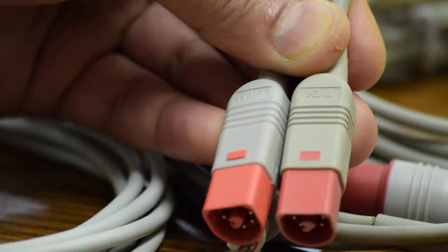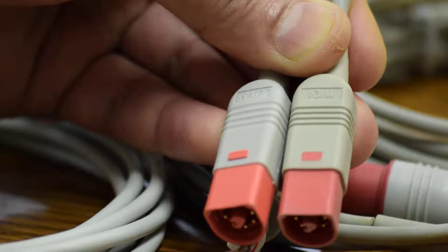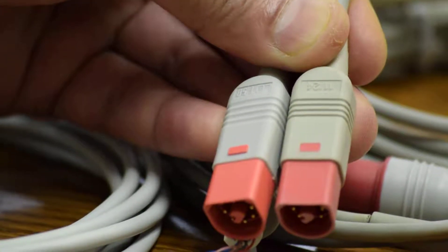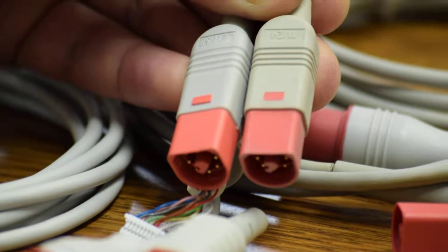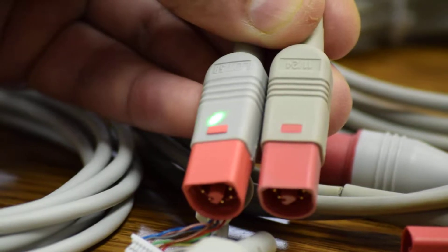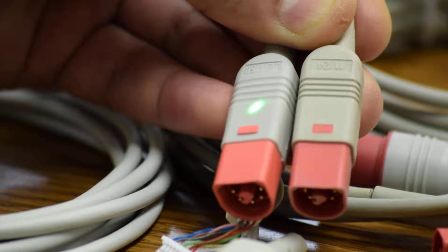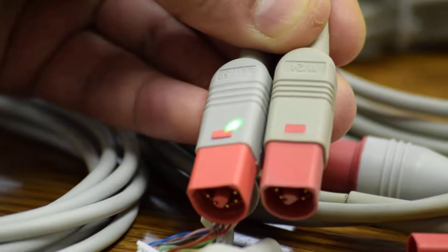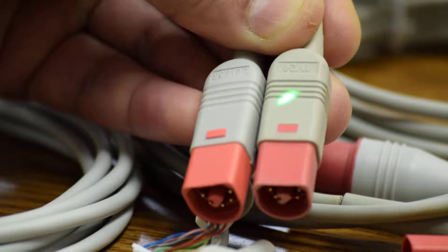Welcome to Toko Expert channel. Seen in the center here, there are two connectors from Philips Avalon fetal monitor transducers. The cable on the left, where it says 'Lot 5B,' is an original connector from Philips. On the right is an aftermarket connector.